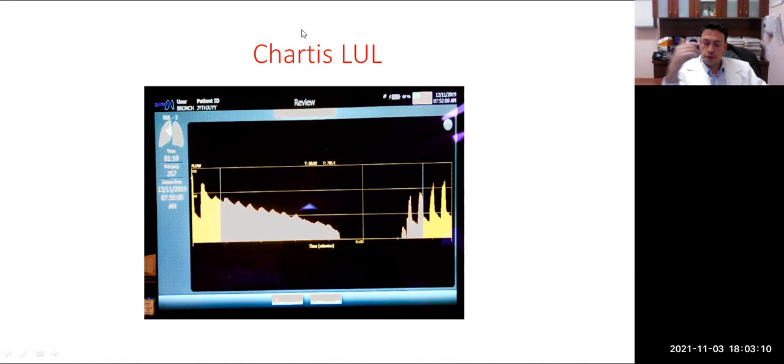We know, for example, from the data that was done on cone beam CT scans, there's actually been a lot of data that came out in the IP journal and other journals that looks at doing lung biopsies with cone beam CT scans, and they've demonstrated very nicely that in just a few minutes after putting someone on a vent, intubating someone, with the patient being supine, you develop significant atelectasis in the lower lobes. We know that from the lung biopsy papers.